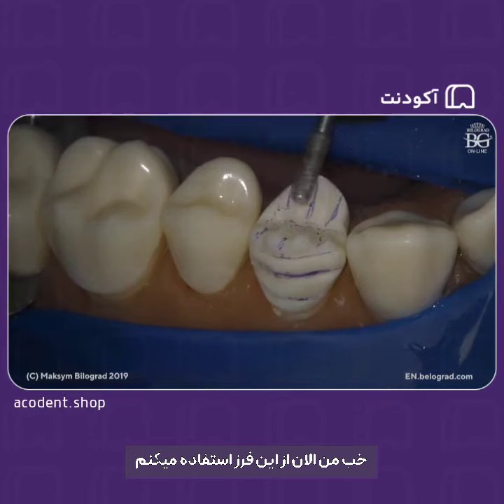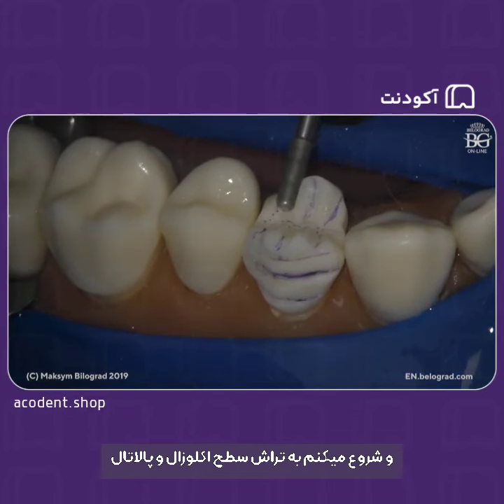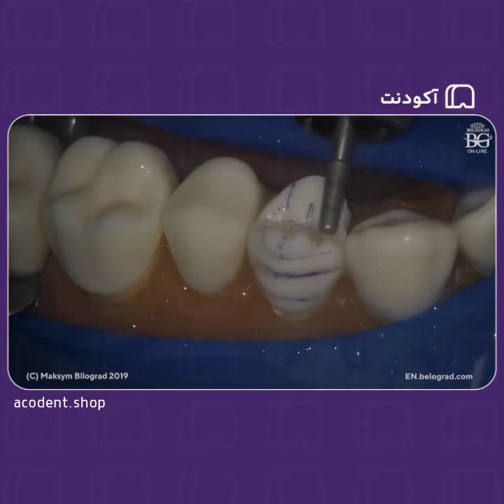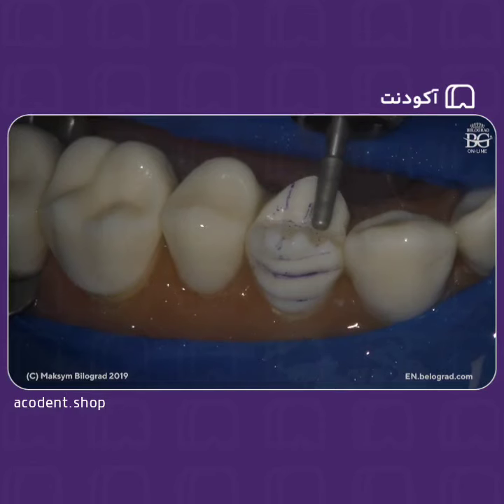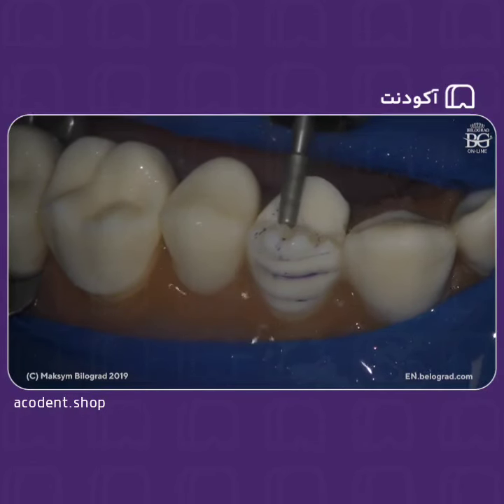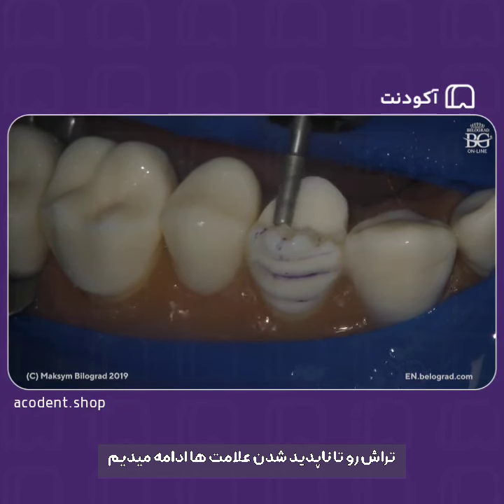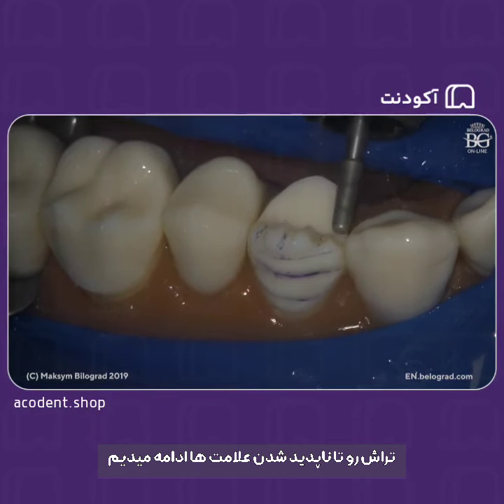So I will just take this burr now and start preparing the occlusal surface, palatal, all the way until you lose the grooves.